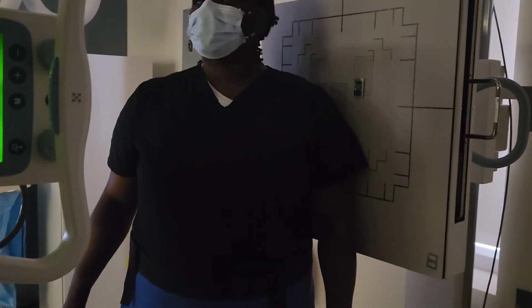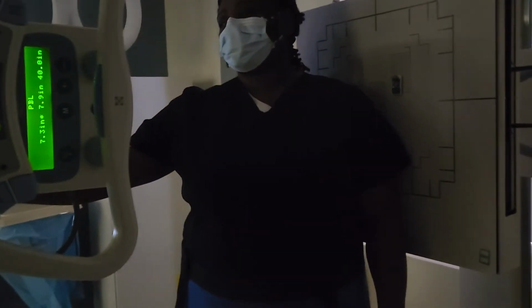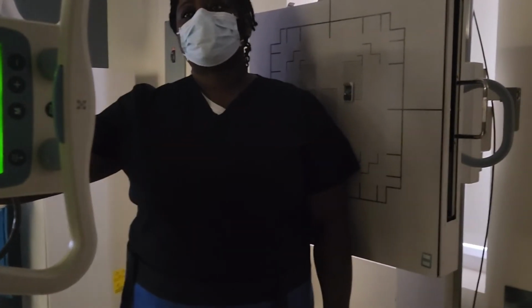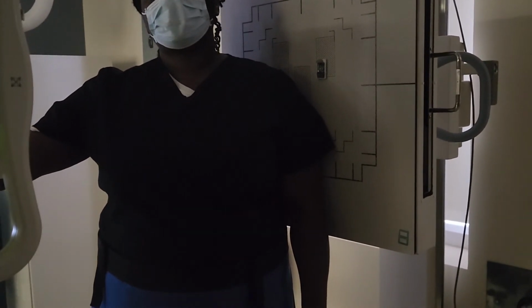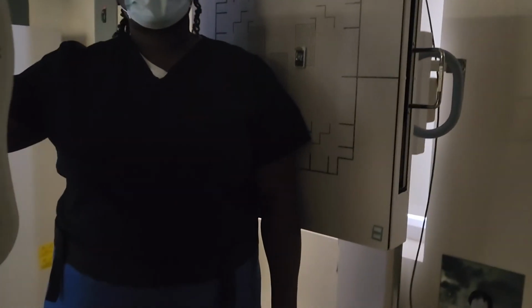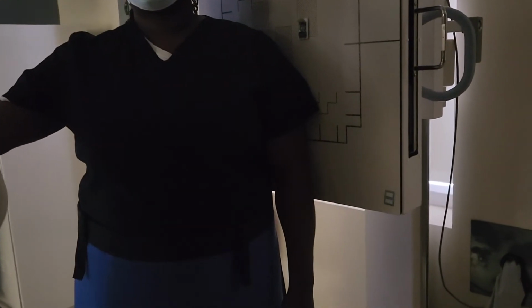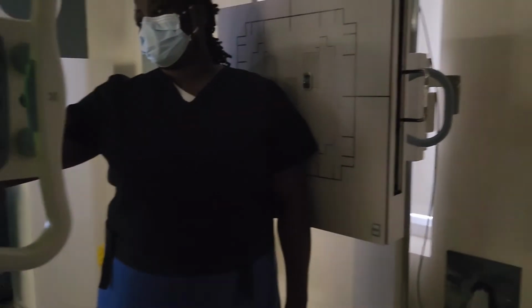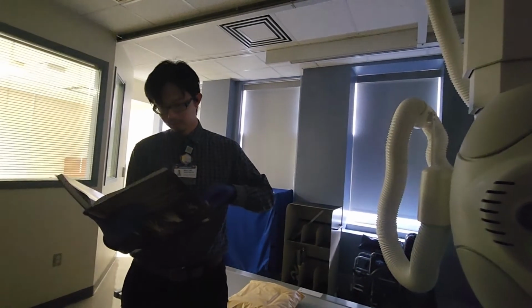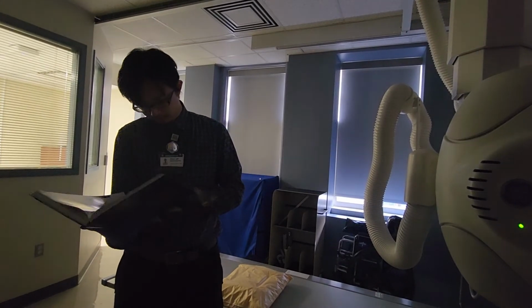All right, let me double check. Sorry. I guess I should read the textbook. I have a question. Yes, question, go ahead. Can you hear me? Yes. So anytime that you're doing the projections for the shoulder, do you have to have them turn the opposite way so that their chin's not in the way? Does that even matter? Not all the time, but it's a good habit. So you don't need to do it all the time, but it's a good habit to have them turn the opposite way. Yes. Okay.